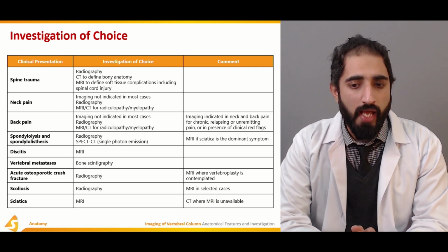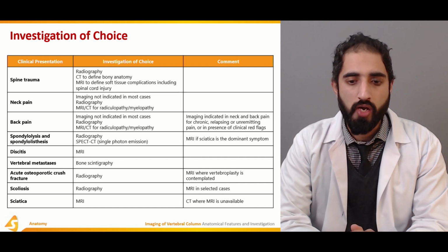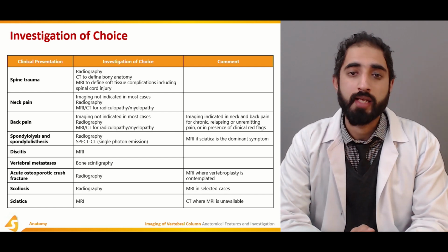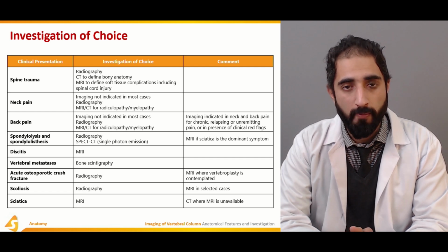Imaging is indicated in neck and back pain for chronic, relapsing, and unremitting pain, or in the presence of clinical red flags. We're going to discuss and mention these red flags in the upcoming slides, so stay tuned for that as well.